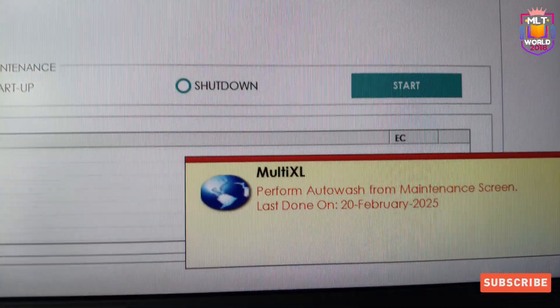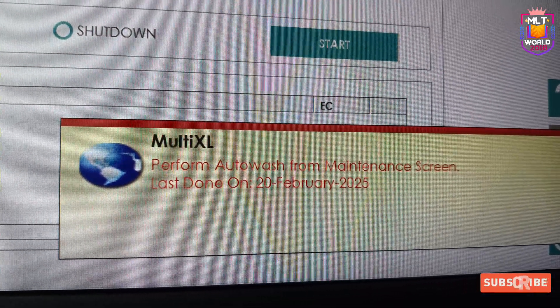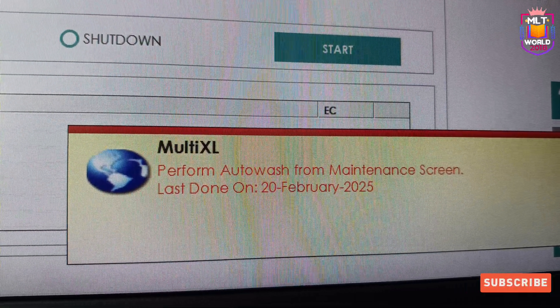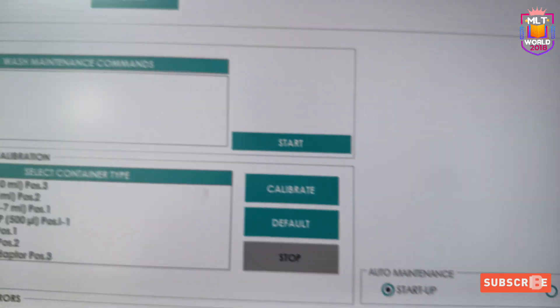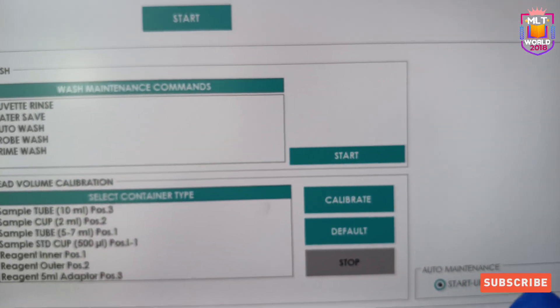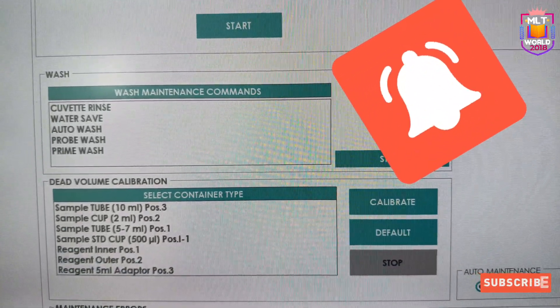Whenever you have to perform the maintenance, the machine will show a reminder. A pop-up message will come on the side of the screen to perform auto wash maintenance, and the last date it was done will also be shown. First you have to select the auto wash option and click the start button.